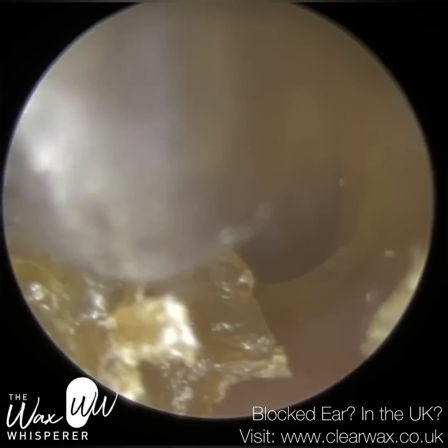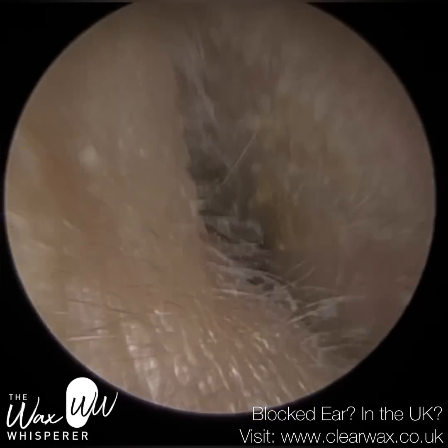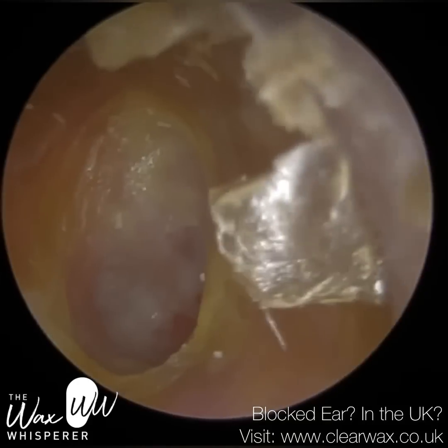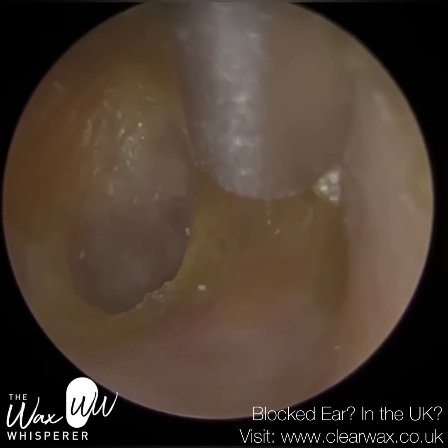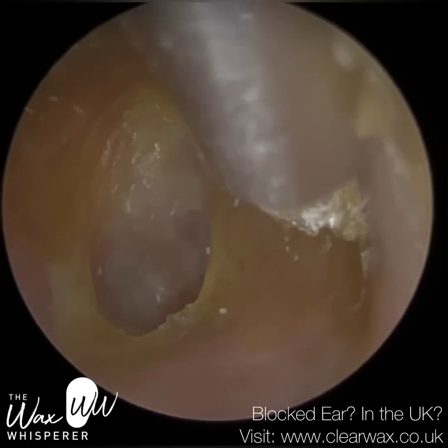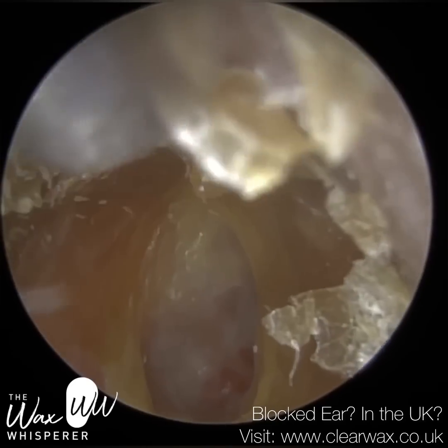Sometimes, though, that granulation tissue doesn't heal just by using antibiotic drops. And sometimes ENT need to cauterize the ear. The concept behind cauterizing the ear, and they use silver nitrate to do it, is essentially you're burning away this granulation tissue in the hope that when the ear reheals itself, so it has a second attempt, the granulation tissue doesn't reform. I've seen it done a couple of times, and it's a very skillful procedure done by ENT specialists and consultants.